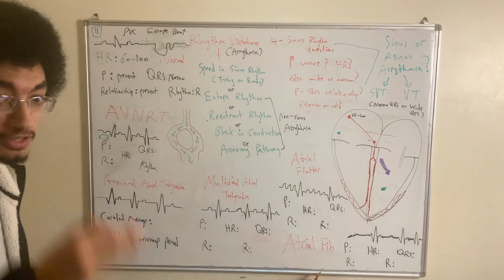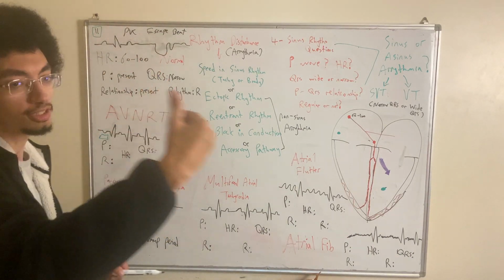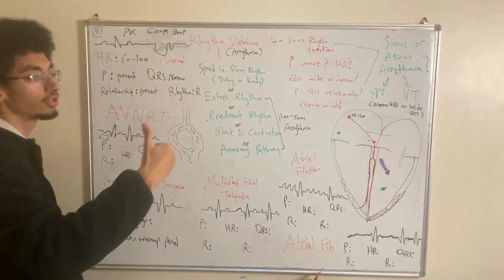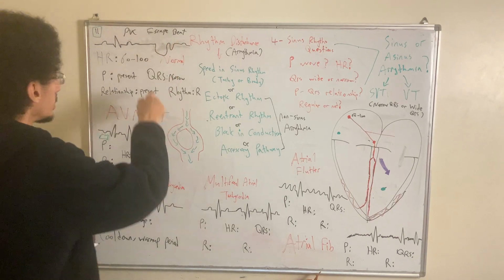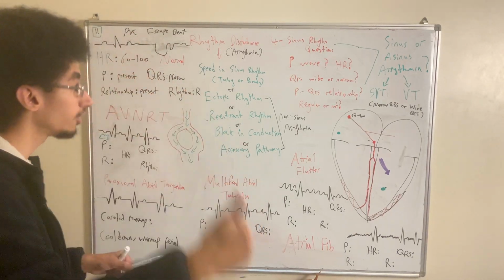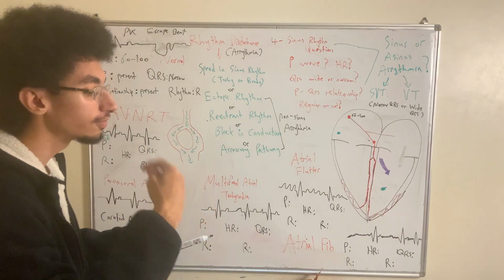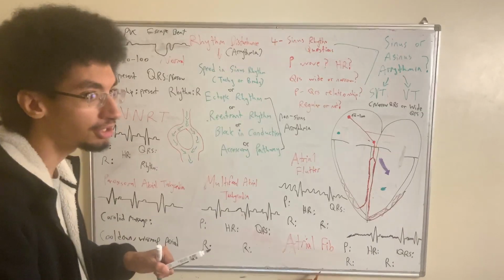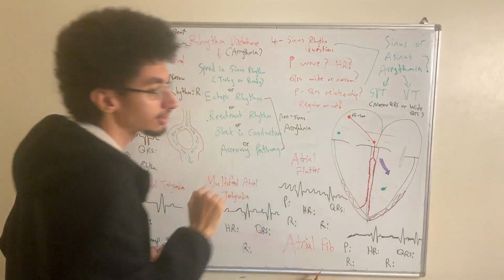The only difference between the two, this one will occur following a sinus arrest. This one will occur late, following a sinus arrest. This will act as a life support. While in PVC, this one will occur early, premature, as soon as possible. And this one could be dangerous if we look for specific signs, which we will see in the upcoming videos, because this can predispose to ventricular tachycardia.